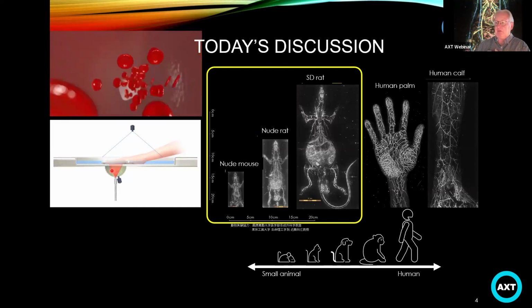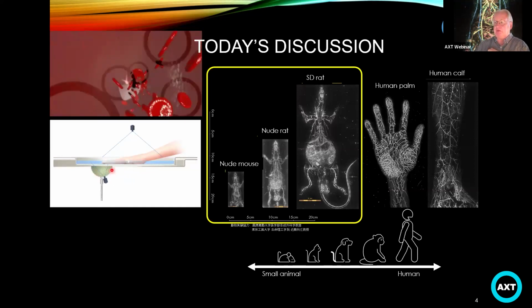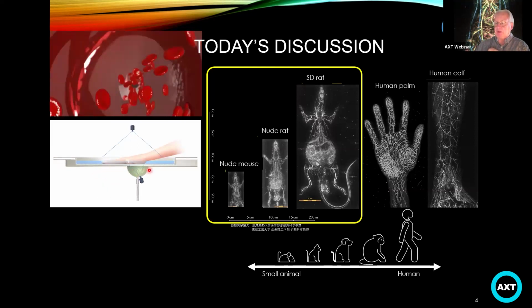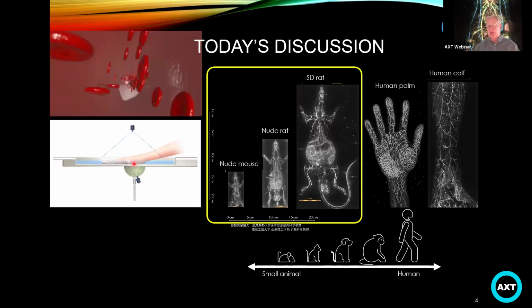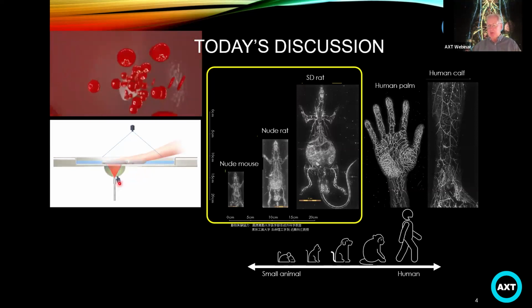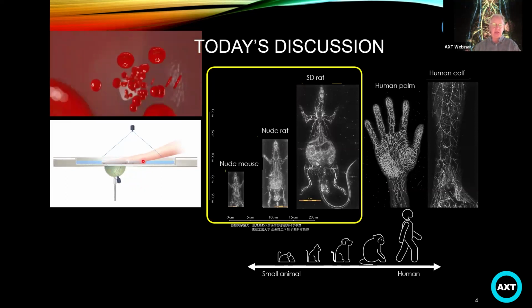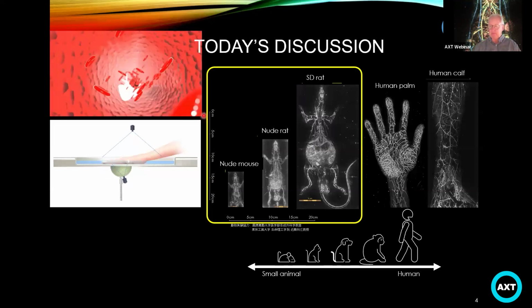The system itself includes a hemispherical detector array, which scans underneath the tissue, in this case a hand, and below that is a laser which provides the stimulation to produce the ultrasound signal, and a small camera to actually take an image outline of the tissue in question.